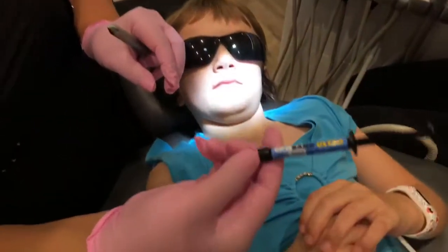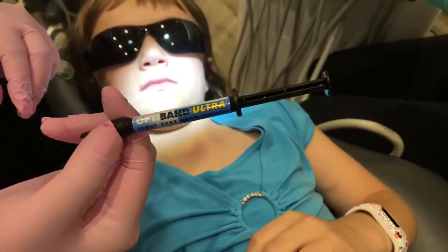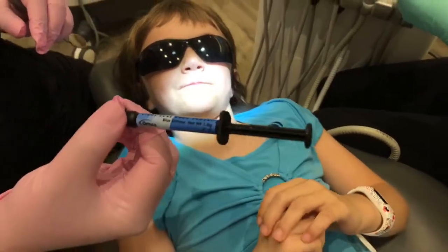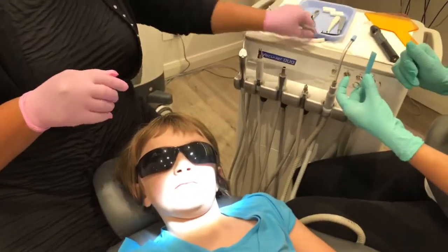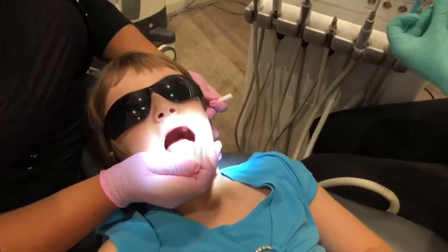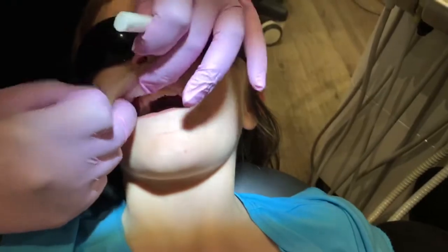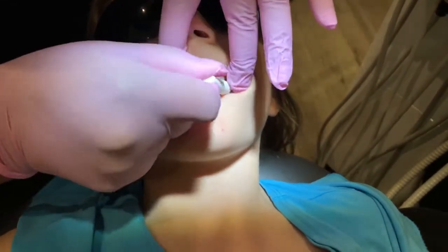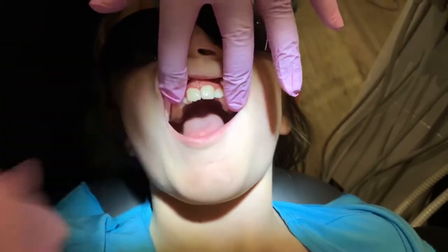What we're using here is Opti-Band Ultra. It's a GIC cement, which is blue in color — easy to remove — and it's a light-cured GIC. So we're going to isolate the two teeth together using cotton rolls. I prefer cotton rolls because we're going to get some help here for biting. So we're going to get started now.